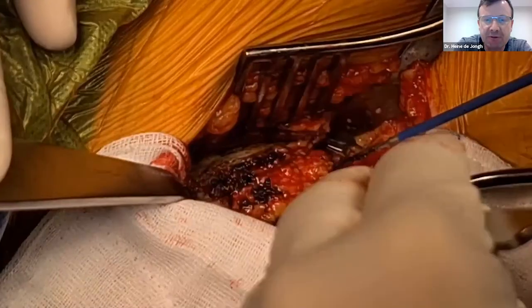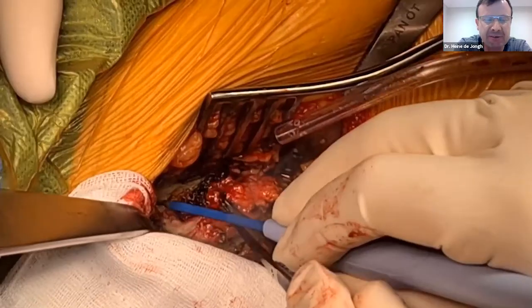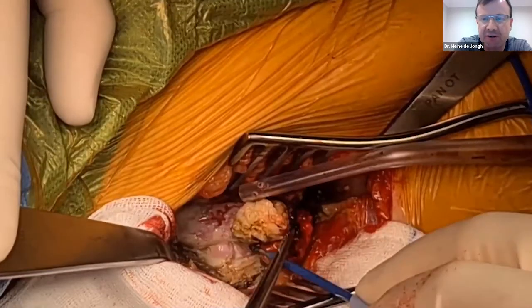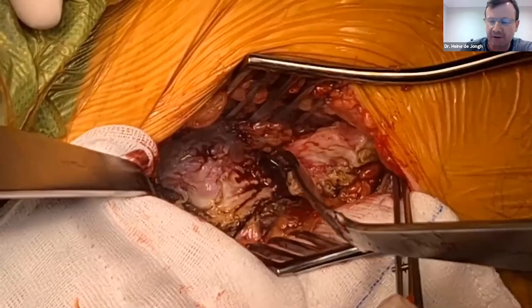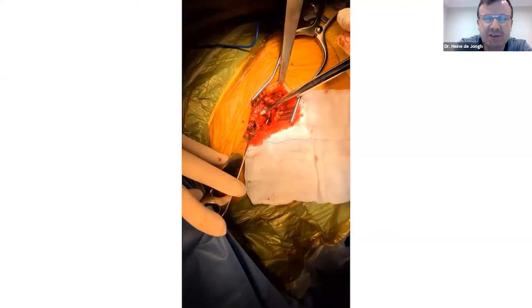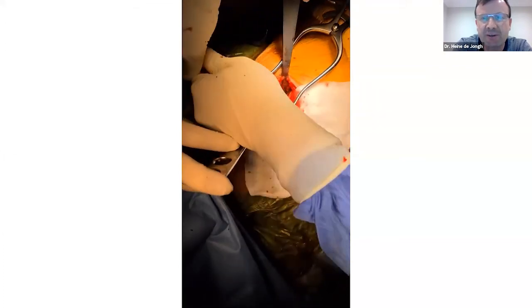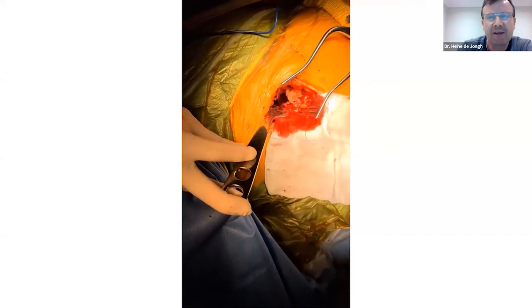I've started to throw it medially because there was too much abundance on the lateral side, and I feel the tensor fascia is protected by a simple swab that you can see here. You don't need anything more than that. And here you can see me going intra-articularly with the Homan. Getting the femur head out is not that difficult without the traction table. This is a technique I use. Just go into hyperflexion, and then it pops out. If you struggle, just ask the assistant to give the leg a little bit of a pull.